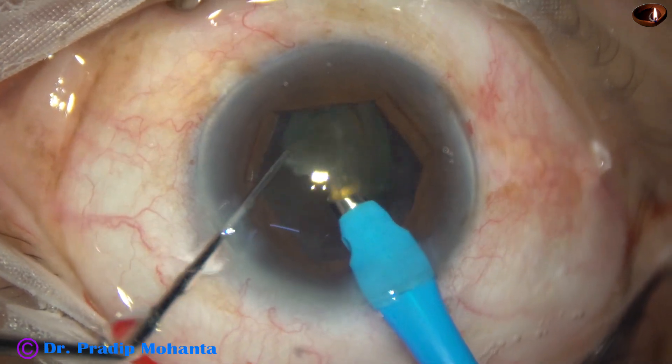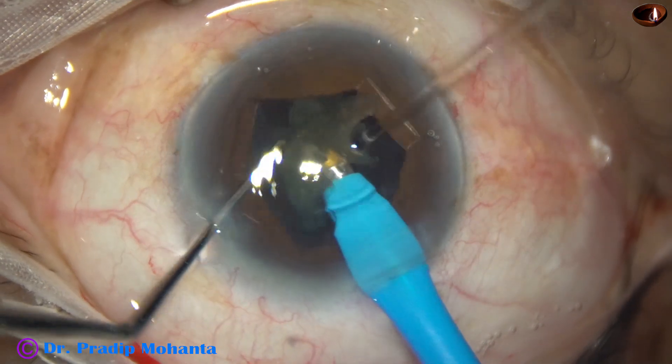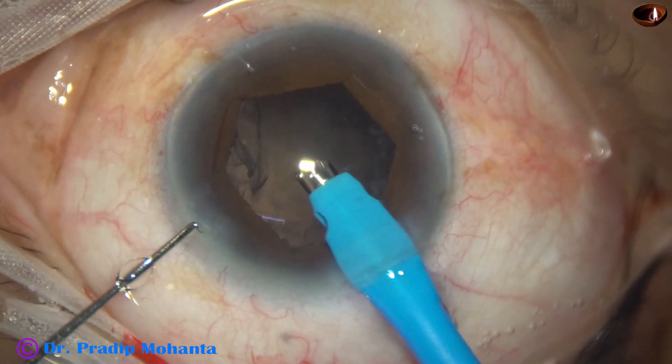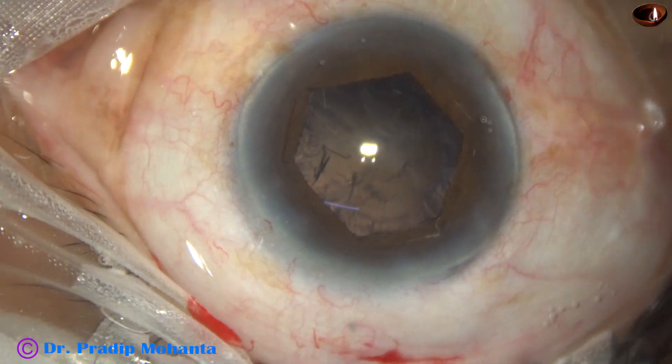This is the last nuclear piece. At this time the vacuum is reduced to 350 mmHg and the flow rate to 35 ml per minute. The last bit of nucleus is managed.